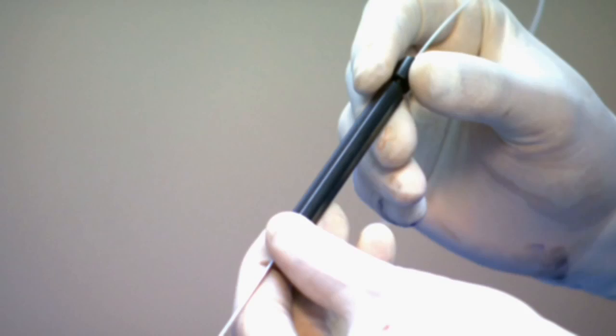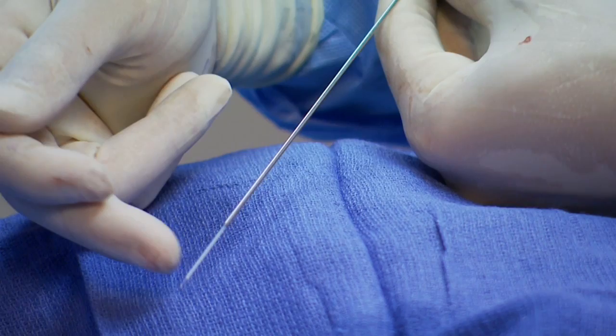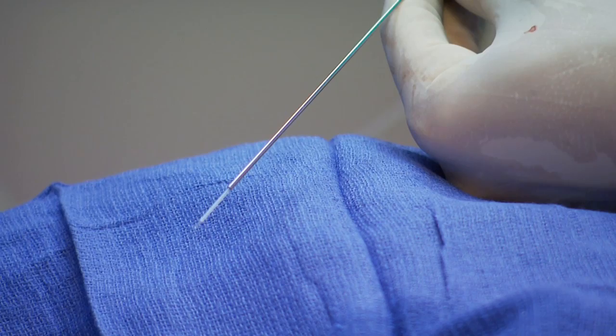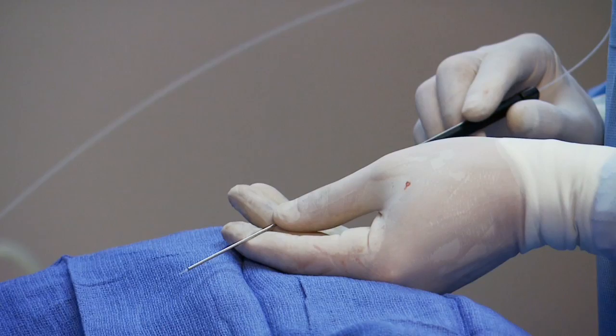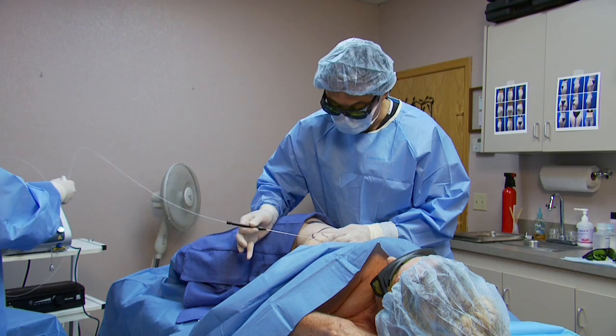Right now I'm holding the La Aveda handpiece. You can see this is a very tiny 600 micrometer laser fiber, which has a sheath and then several millimeters of exposed laser fiber that's polished at the end. I'm going to bring it back so that the sheath portion is just flush with the edge of the cannula. The opening is very tiny, about three millimeters, and you can see that I just placed it right under the skin — it just goes pop right under the skin.